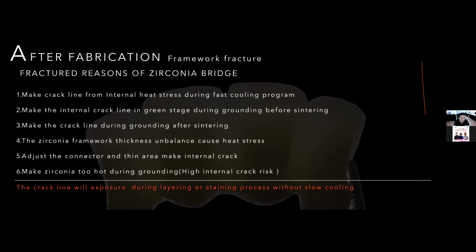But when you bake it again, but without the slow cooling, maybe this crack line will grow and become more and more and more, and the unit will break. And even if it's not broken, you have a very strong and bigger crack line inside, and you don't discover it. You finish this case to your dentist. Maybe in the patient's mouth, during half a year, the unit will break. So please make sure every time you bake your framework, use the slow cooling procedure.